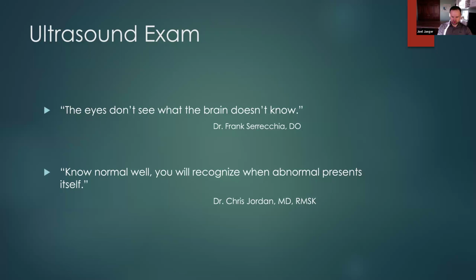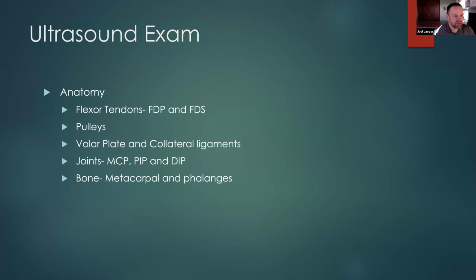I think we all use Jacobson's as a really good resource for developing our ultrasound. And I think his second chapter on pathology concepts is actually a great place for a lot of people to start and learn those things well, so they're prepared for unexpected things when they're doing their exams. Anyway, getting back to doing the ultrasound exam, the way I tend to organize my protocol is to think more about the anatomy and then go through the different anatomic structures as a checklist in my mind.